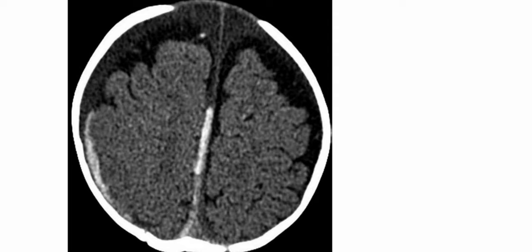So the key imaging finding here is of the subdural hemorrhages of varying ages, and the diagnosis is non-accidental trauma.